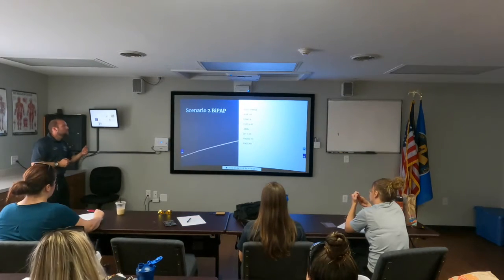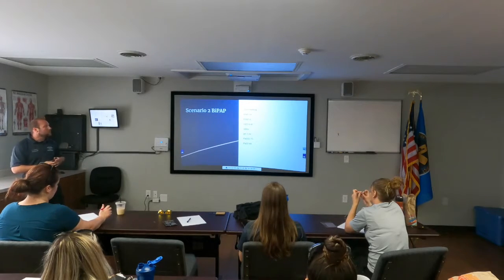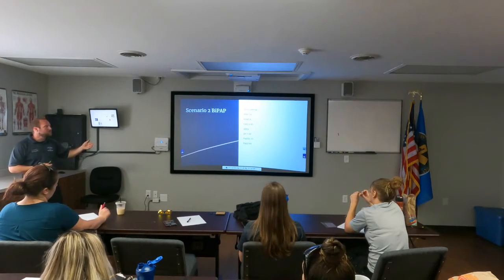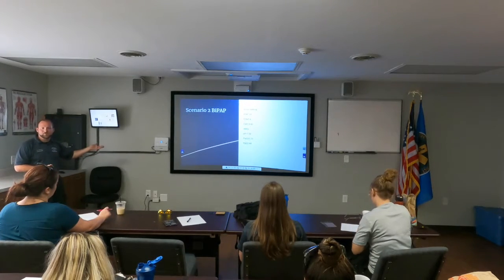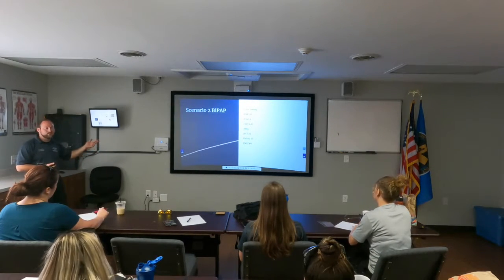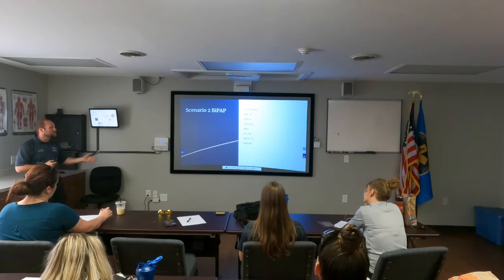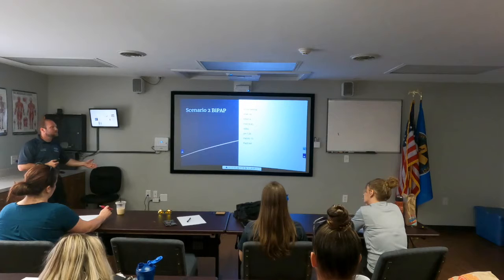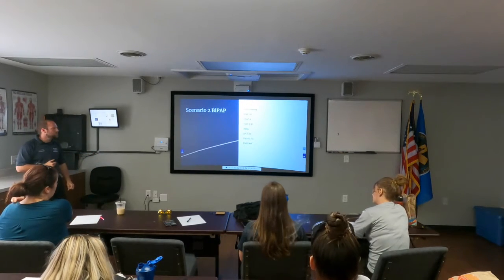So continue on. Again, our initial BiPAP settings are going to be IPAP 10, EPAP 4, FiO2 0.45, so percentage-wise, what is that? 45%, yeah. ABGs, what we are looking at is our pH, our CO2, and our O2. pH is 7.28.